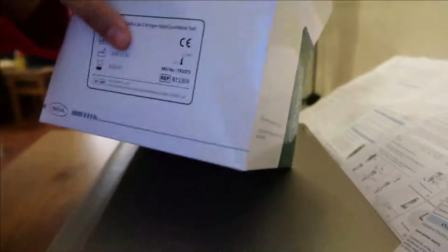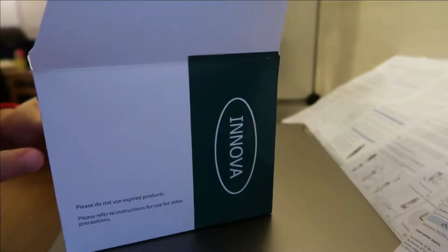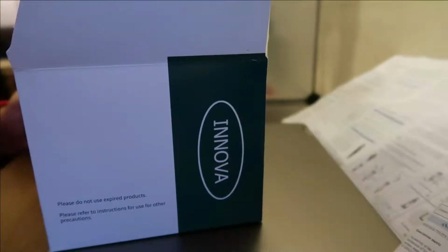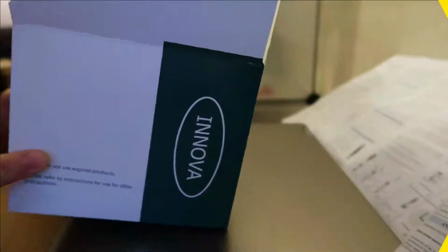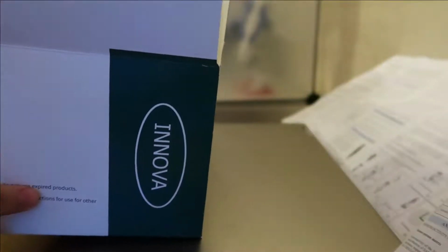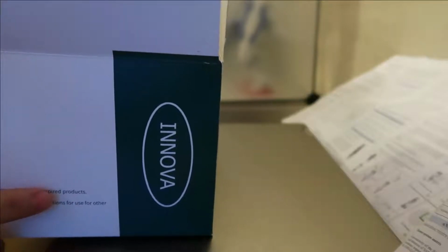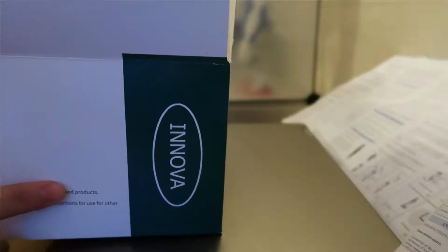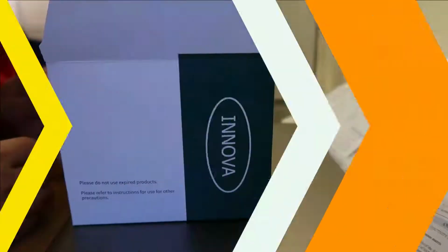It comes in a box, and here there is a lot number and expiration number. This is very important, because when we distribute it to our members, we have to note it online, so that the results can be traced. We were asked that every single time we do our test, which is every 3 to 4 days, so that's twice a week, we need to register it online.